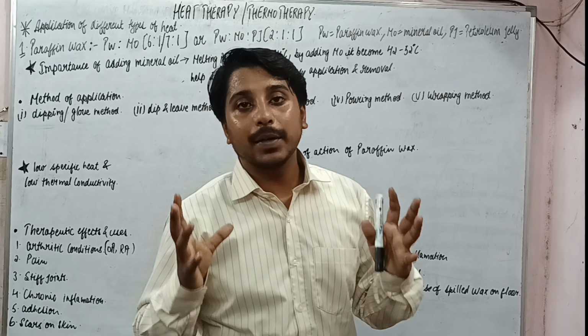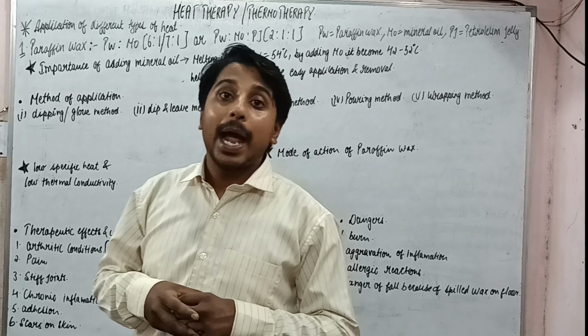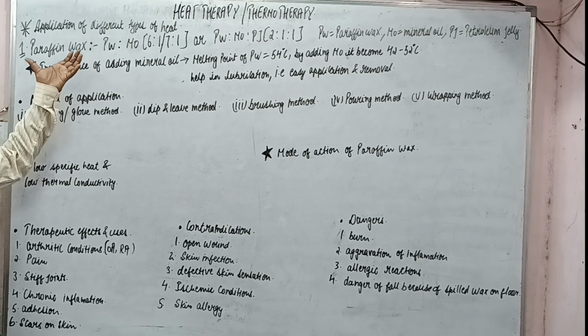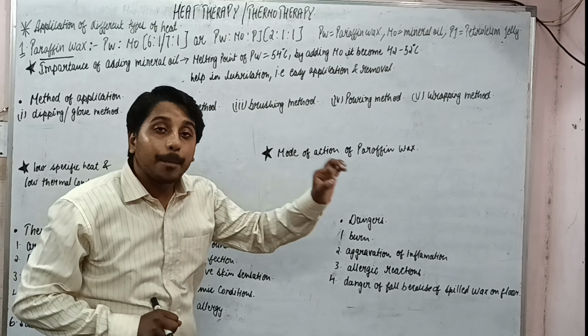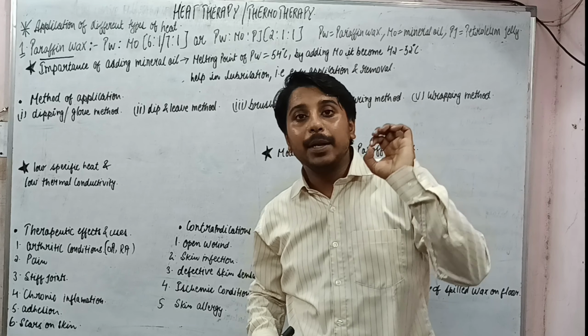We are back with our next lecture on heat therapy or thermotherapy, and now we are going to start our first method of application of heat, which is the paraffin wax bath. So what is paraffin wax? It is a mixture of paraffin wax and petroleum jelly and mineral oil.